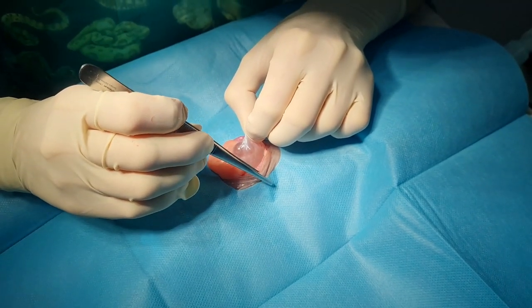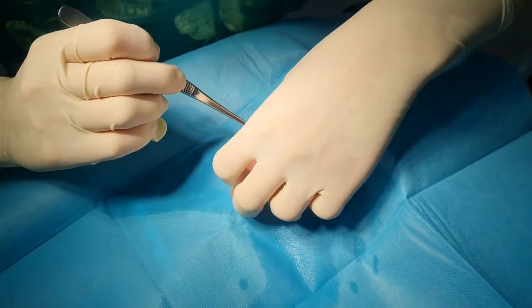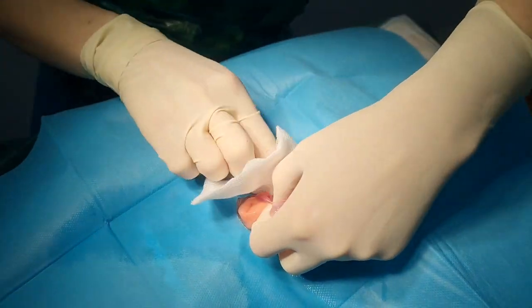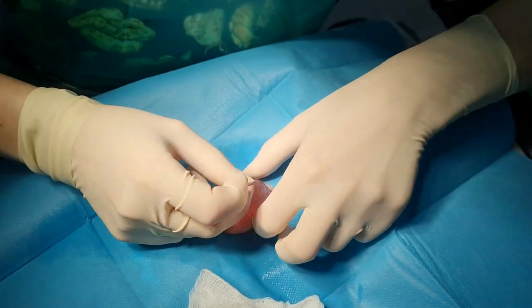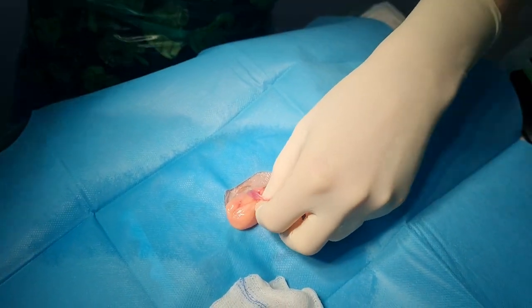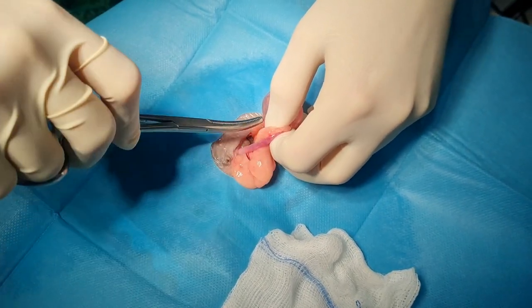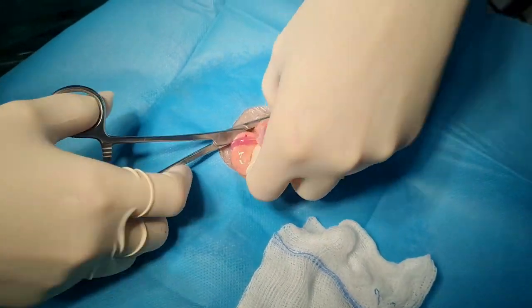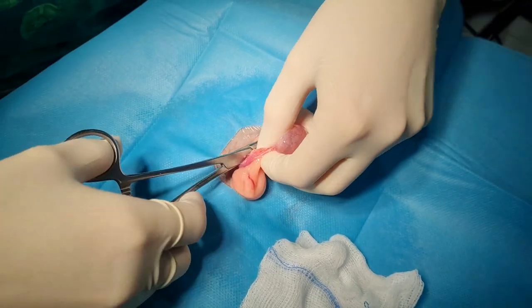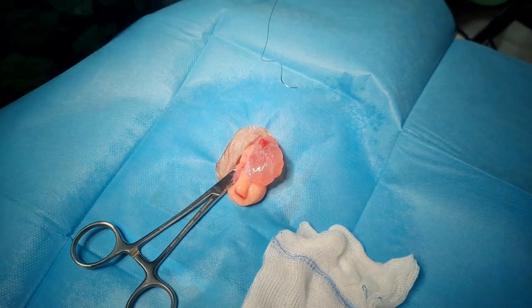Some people do drain these percutaneously before surgery. I'm not a big fan myself. There we go — a ruptured one which meant it came out. Mainly because I'm always very cautious about putting a needle into the abdomen of a herbivore, as there's an awful lot of gut and I don't really want to poke that. That's actually a pretty modest one compared to some, but it will feel a lot better for her once that's out. I know there are vets who don't particularly think these cause much of a clinical problem, but I hesitate to say those might be people that haven't had ovarian pain themselves. We know these guys can be incredibly painful, and I'd rather not risk it.